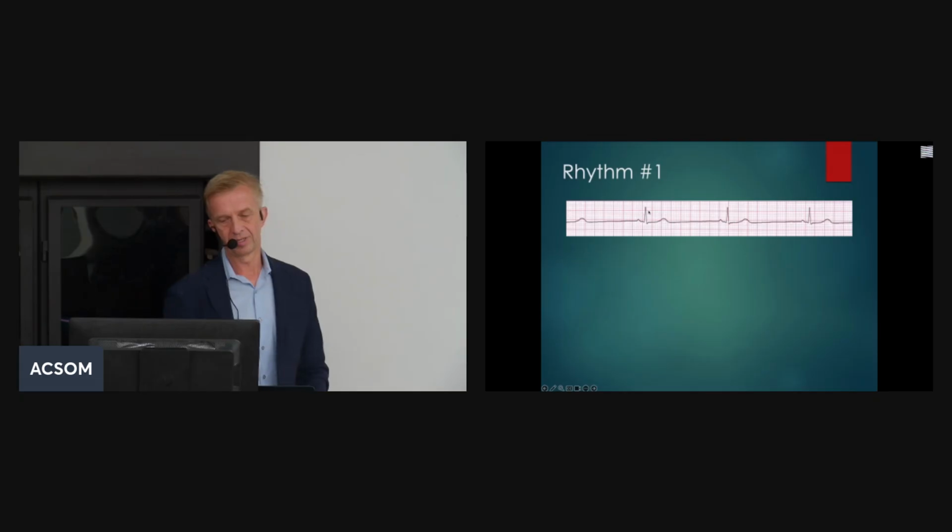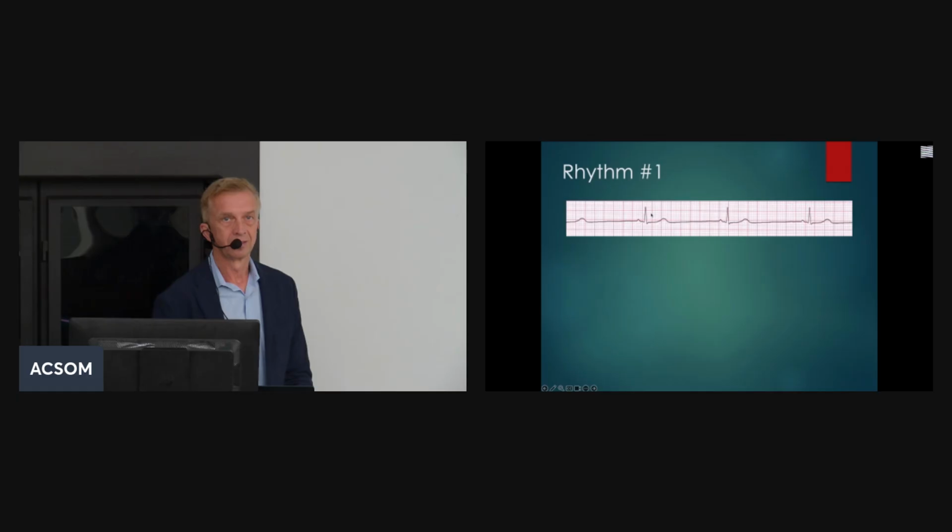So what is the heart rate about? What is 300 divided by 8.5? Do you have a calculator? Right, 8.5, around 35. So how is it called?